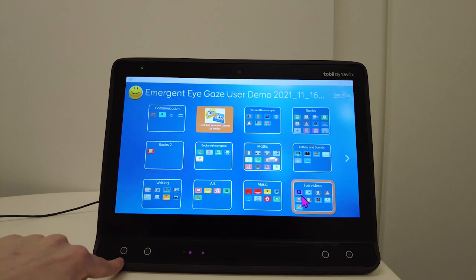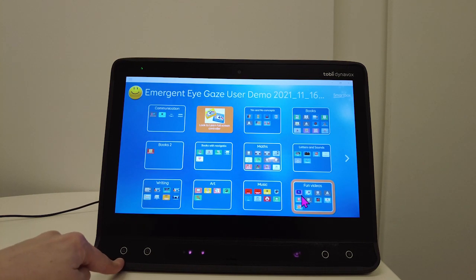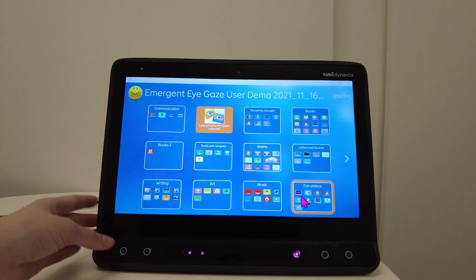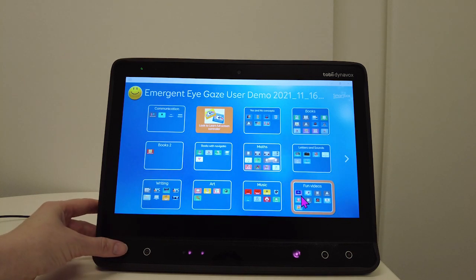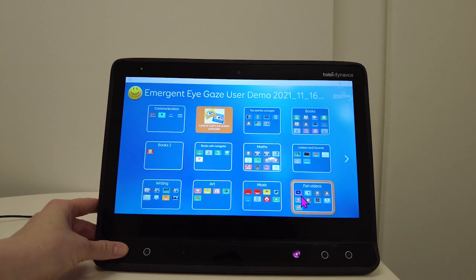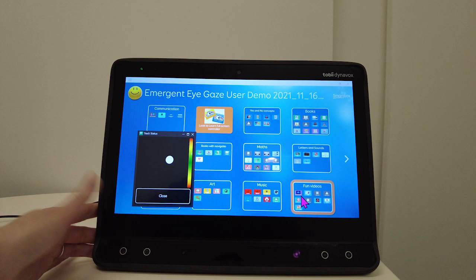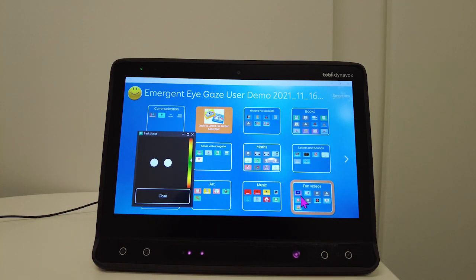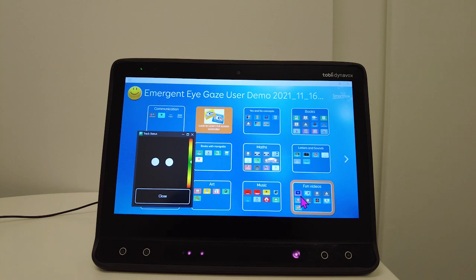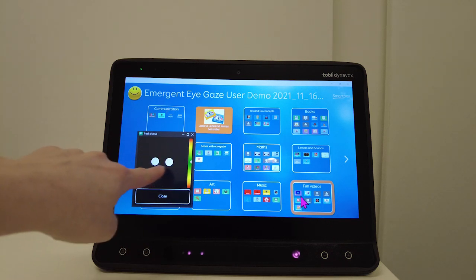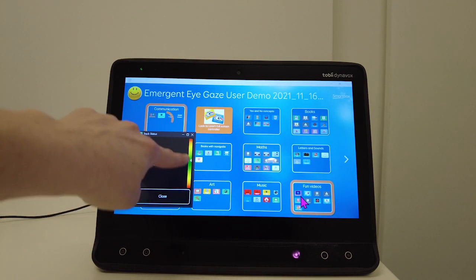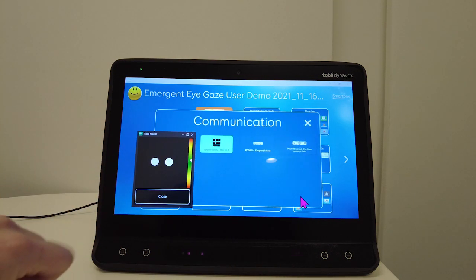Commonly this triangle button on the bottom left is automatically programmed from purchase to bring up the track status box. So I touch and hold that, you can see the track status box has quickly appeared and I can check the positioning of my eyes, that they're in the centre and that arrow is sitting in the green ideally.